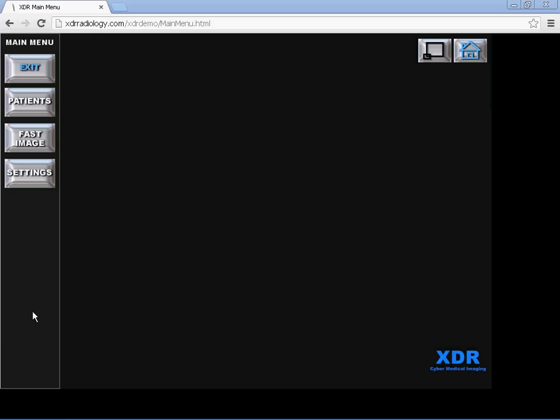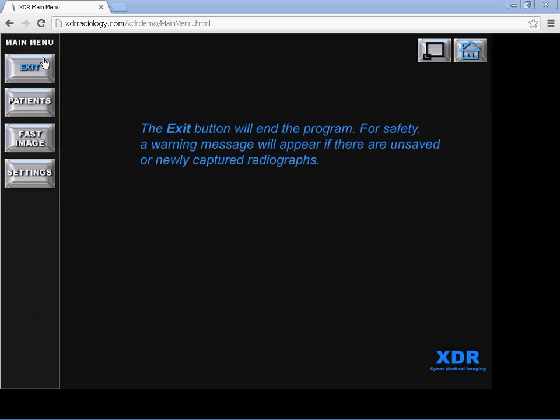Hello, this is the XDR imaging software main menu. There's an exit button which will end the program. For safety, a warning message will appear if there are unsaved or newly captured radiographs.